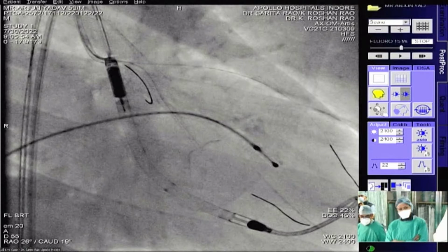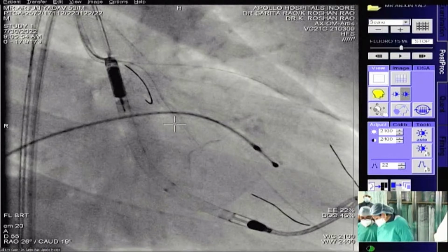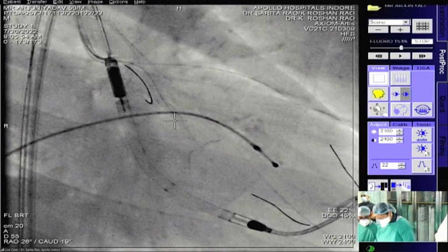Yes. What do you do, Dr. Benson? Yeah, I would go the same way. I would stent from left main into LAD and then do a POT, re-enter the circumflex, balloon dilate the struts, and then do a repeat POT. That's what the EBC does currently.